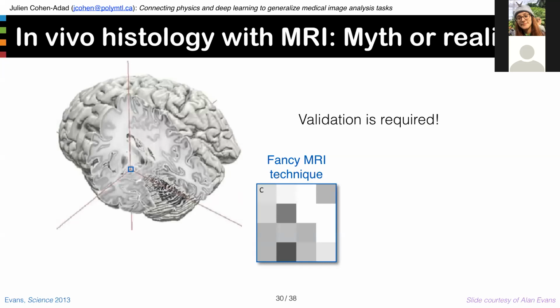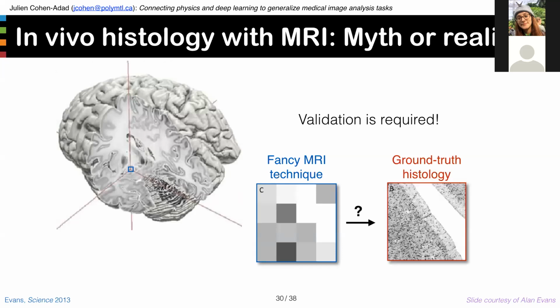And one question that many researchers have is, how accurately does MRI measure represent the actual reality of my tissue? So one way to answer that question is to basically reverse engineer that by using histology. So we would basically take the same tissue and do histology on that with high resolution techniques.